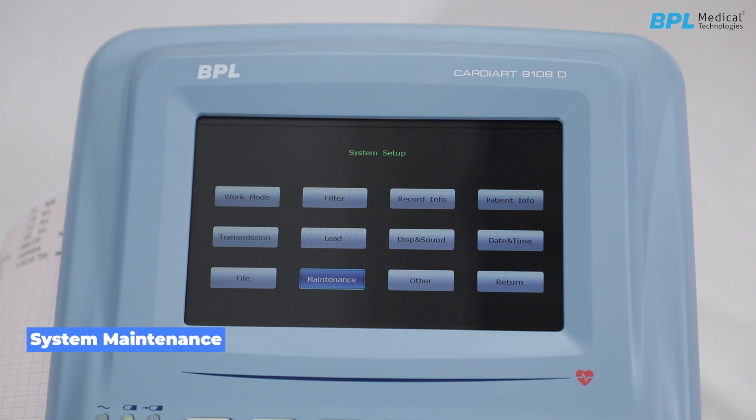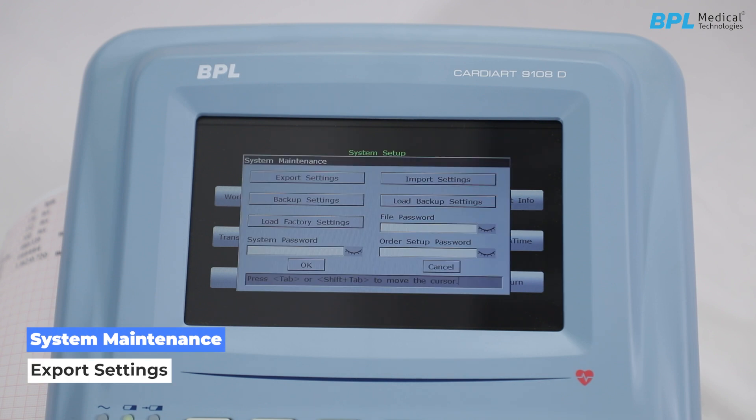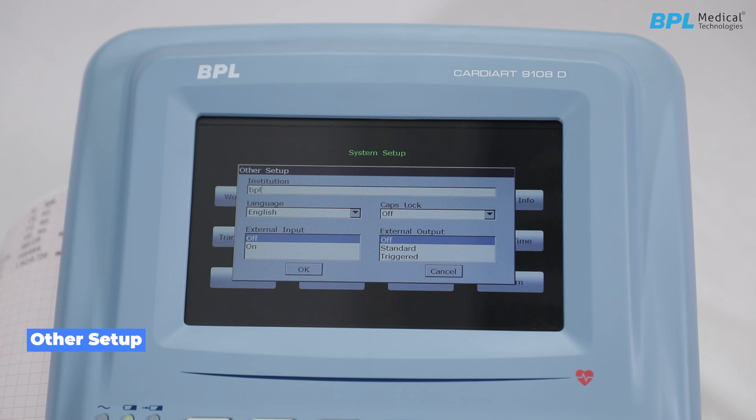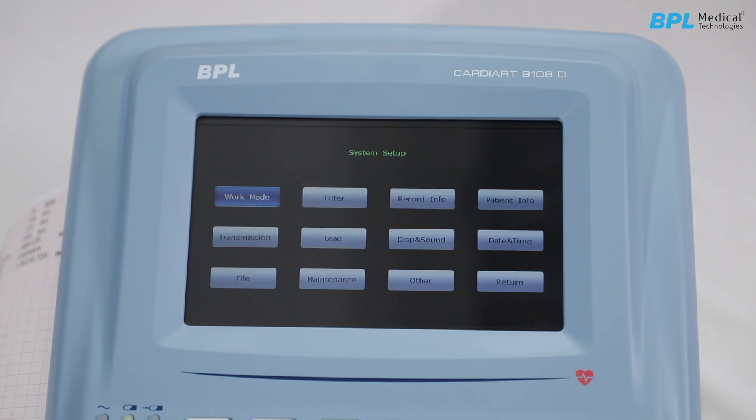In system maintenance, options include: Export settings to export system settings to USB; Import settings to load system settings from USB to the ECG; Backup settings; Load backup settings; and Load factory settings. Under other setup, you can enter the institution or hospital name. Language is set to English by default. Caps lock can be turned on or off. This concludes the system setup.